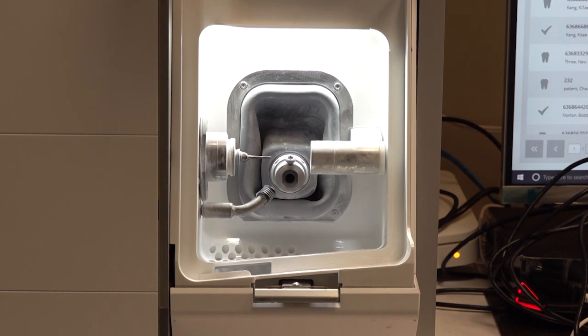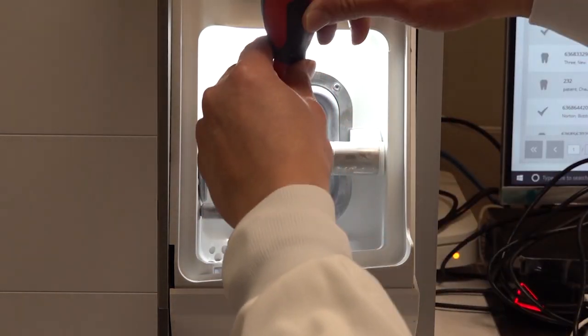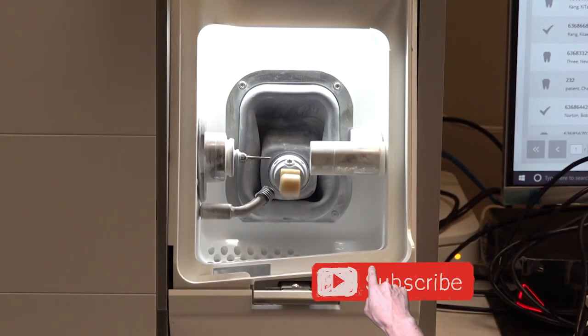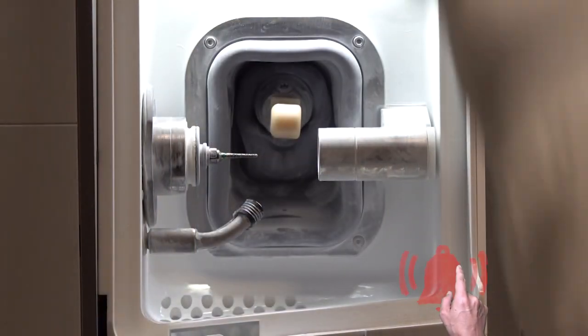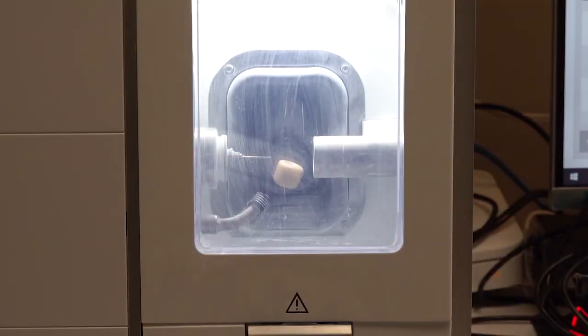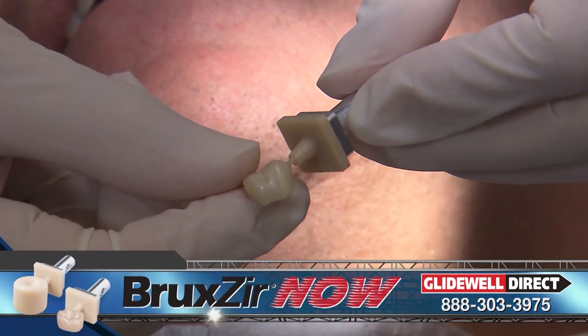When the design is complete, how does a 35-minute turnaround time for a fully sintered Bruxer crown sound? It's kind of unbelievable and shouldn't even be possible, but I'm amazed every time — after I lock a Bruxer Now block into my Fast Mill, I get a perfect fitting Bruxer crown that's ready to be delivered.